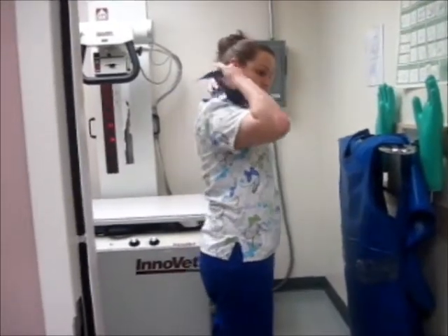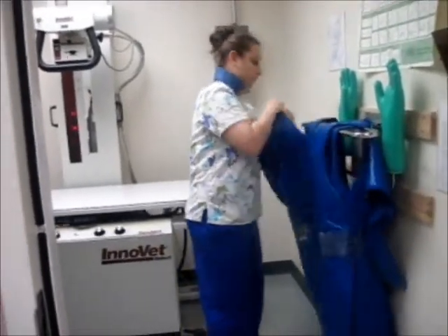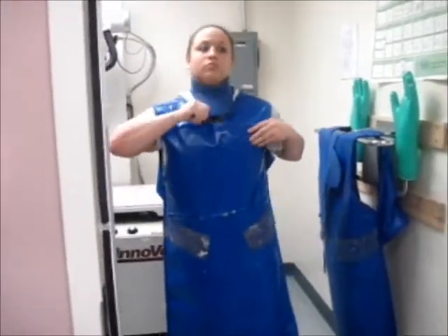Today I am doing a VD x-ray on a parrot. This bird will be sedated for this, so it will make it less stressful on the bird and keep everyone safe.